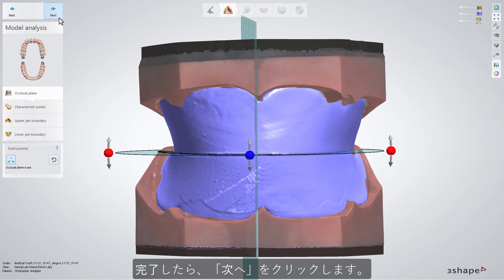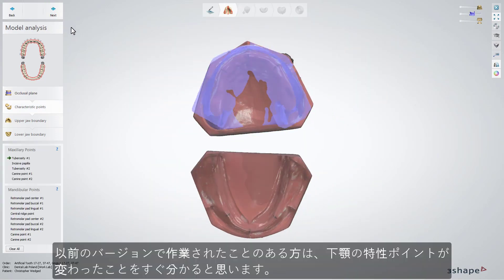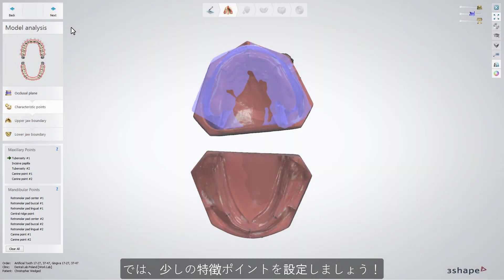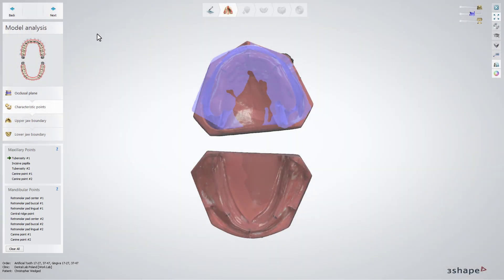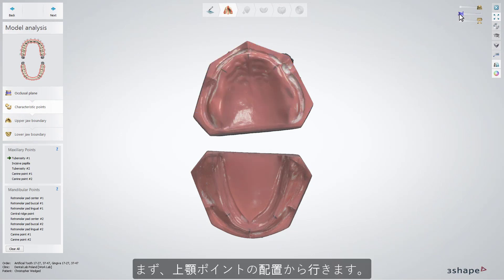Click Next when finished. For those of you who have worked with our previous version, it will be easy to see that the characteristic points for mandibular have changed. Now there are a few more points to define. Start with maxillary points.